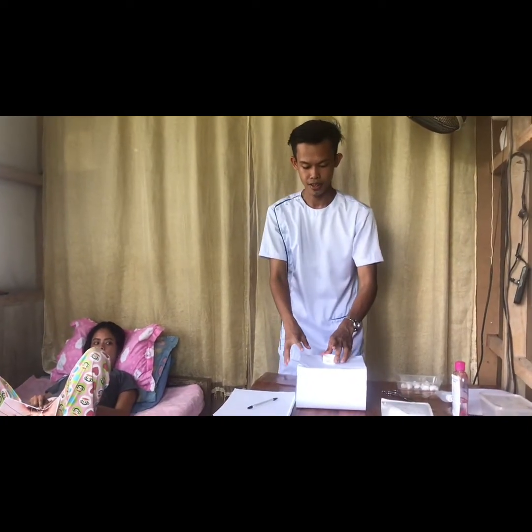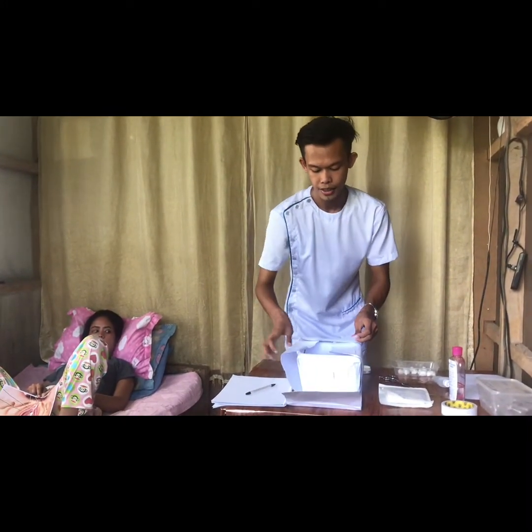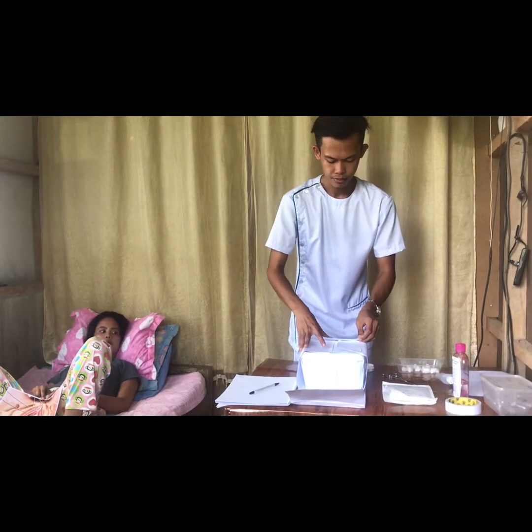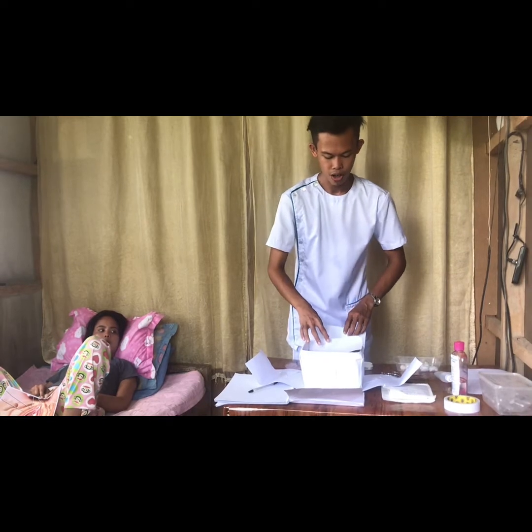This is the catheter kit. In opening the catheter kit, we are going to open the upper portion of the catheter kit, and then after that we're going to open the left and the right side, and then the lower portion of the catheter kit.